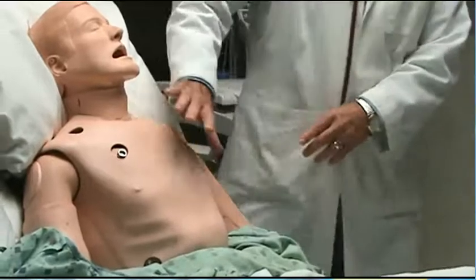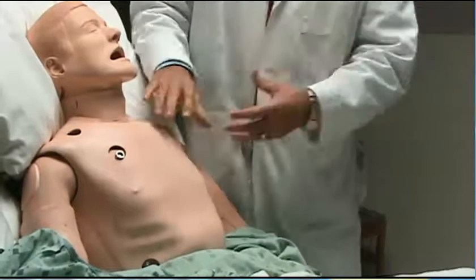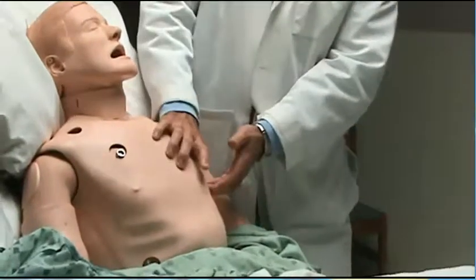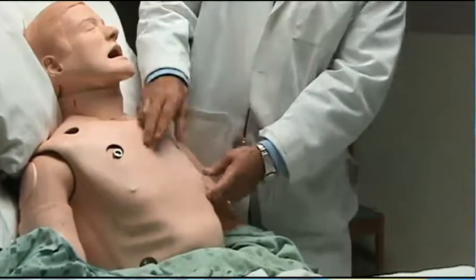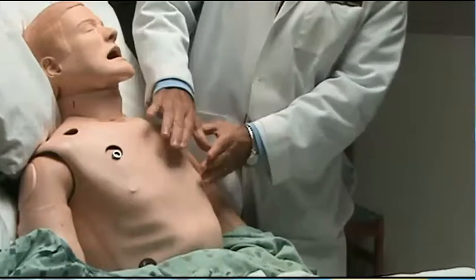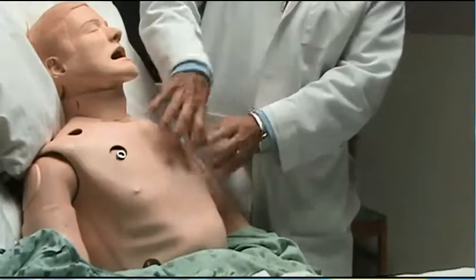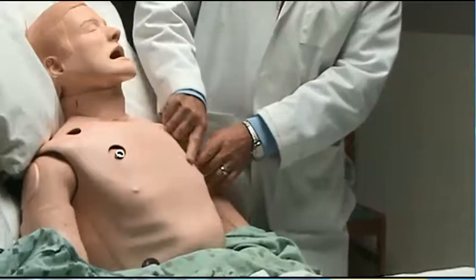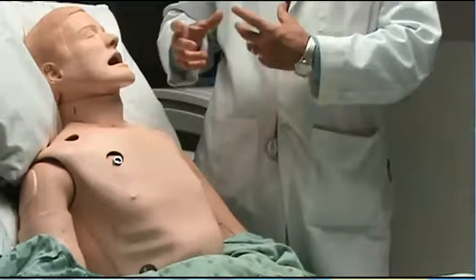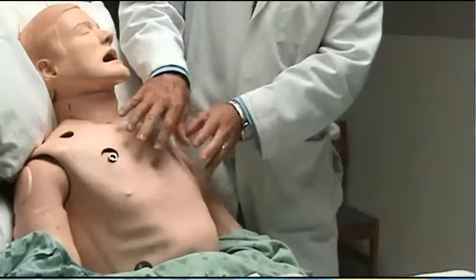The second reason precordial leads get misplaced is in women with pendulous breasts. The breast doesn't have any significant effect on the electrocardiogram, so just pretend it's not there and go right over the top of the breast. If it's a relatively small breast you can follow right underneath it — that's fine too. The key is to pay attention to where those intercostal spaces are. If somebody is obese and you can't find the intercostal spaces, do the best you can — we're not asking you to do the impossible, but be aware of these challenges.